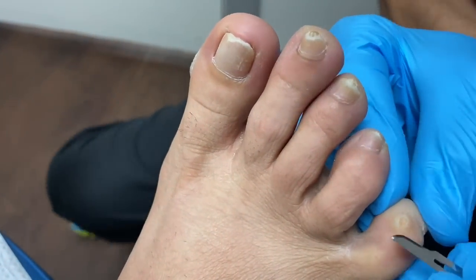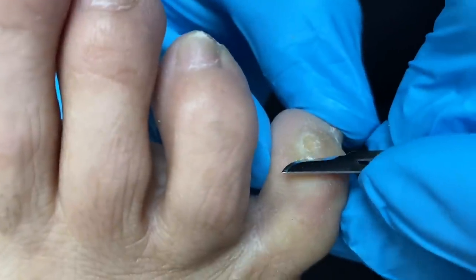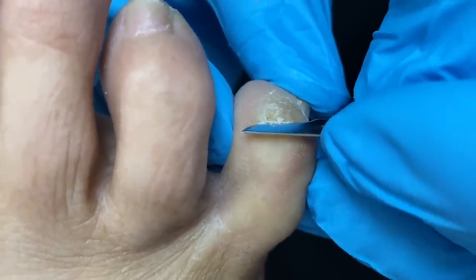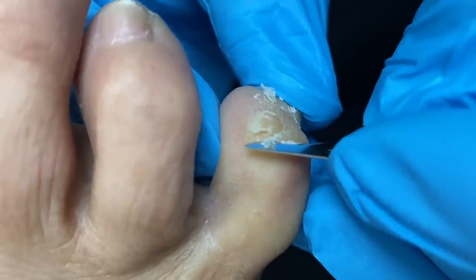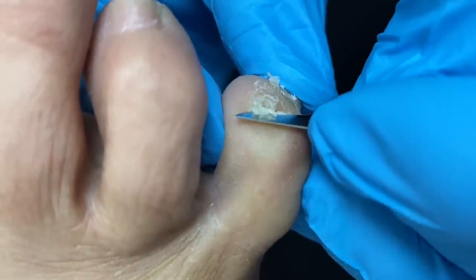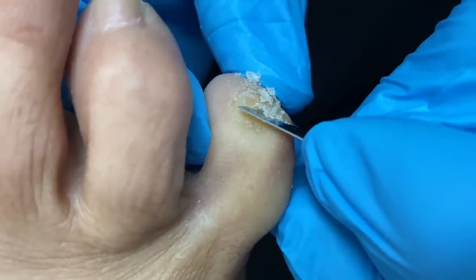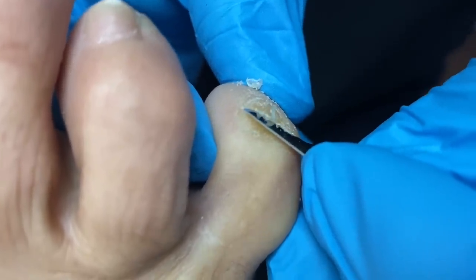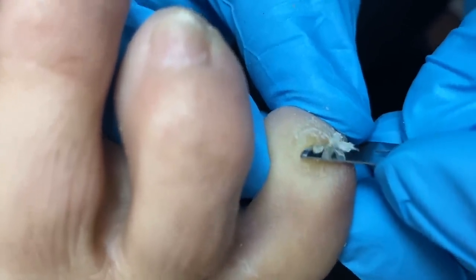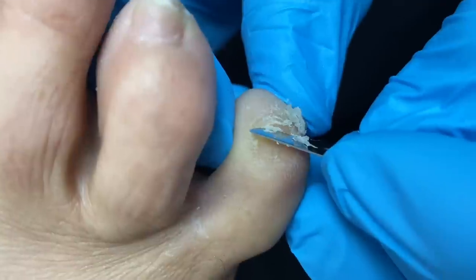Even the patient said it herself: after a week or so, it's back. We want to be really careful because what I'm doing can be a little bit uncomfortable. I've seen these lesions ulcerate and break down to the point where there's blood. But the nice thing — and the unfortunate part — is that the patient leaves here with a big old smile, and then unfortunately the patient will return.